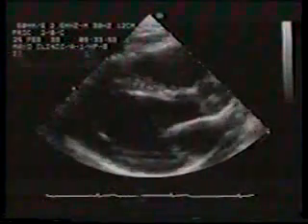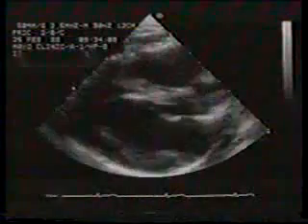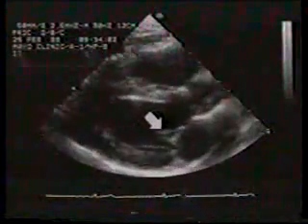This is a peristernal long-axis view. The mitral leaflets appear mildly thickened. In this freeze frame, the mitral leaflets are closed. The color signals of mitral regurgitation are immediately apparent and occupy a very small portion of the left atrium. This is an example of mild mitral regurgitation.